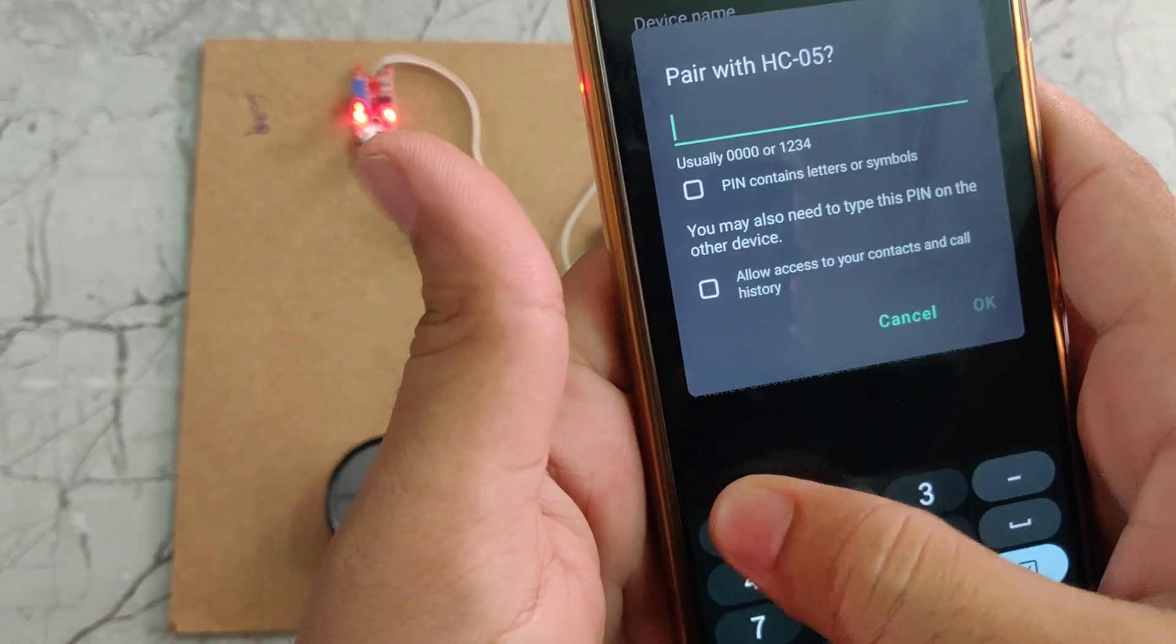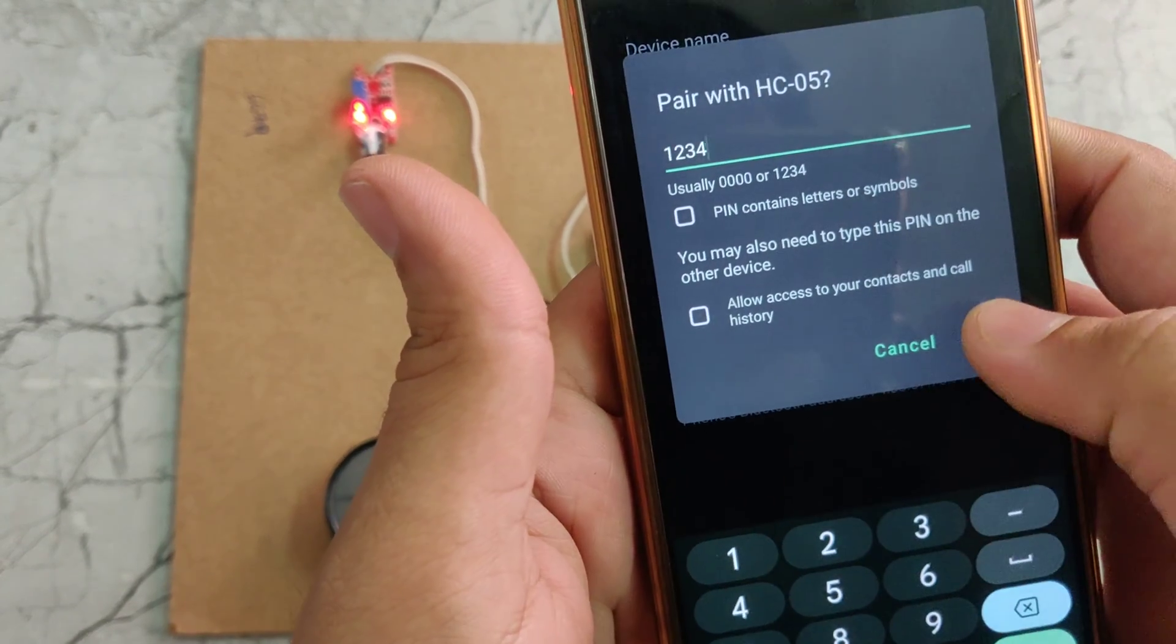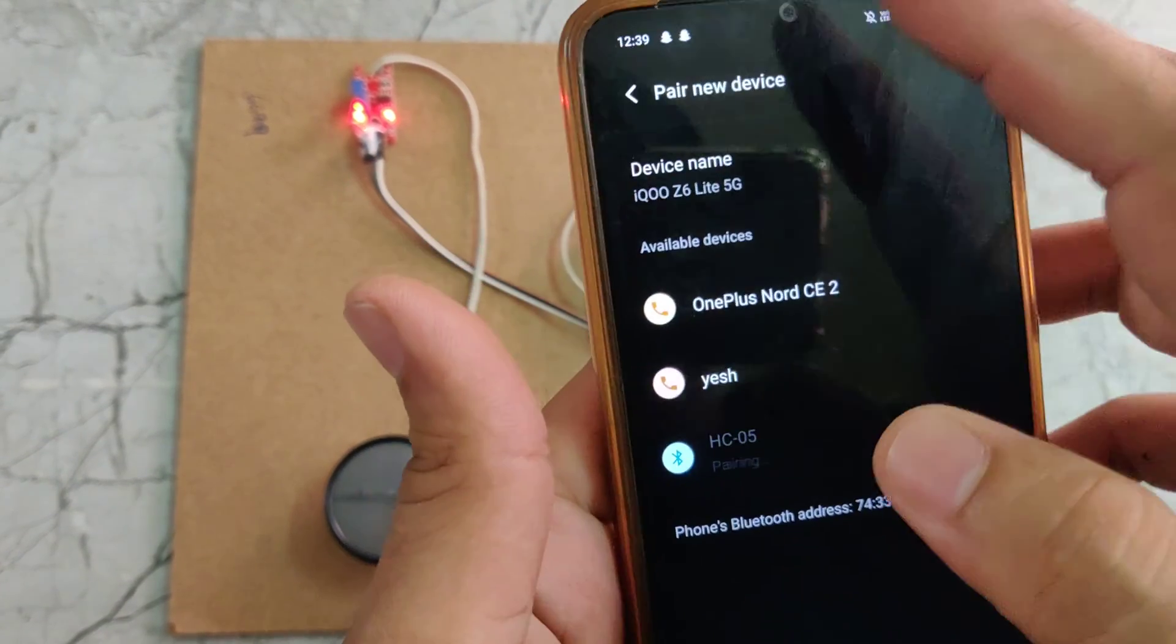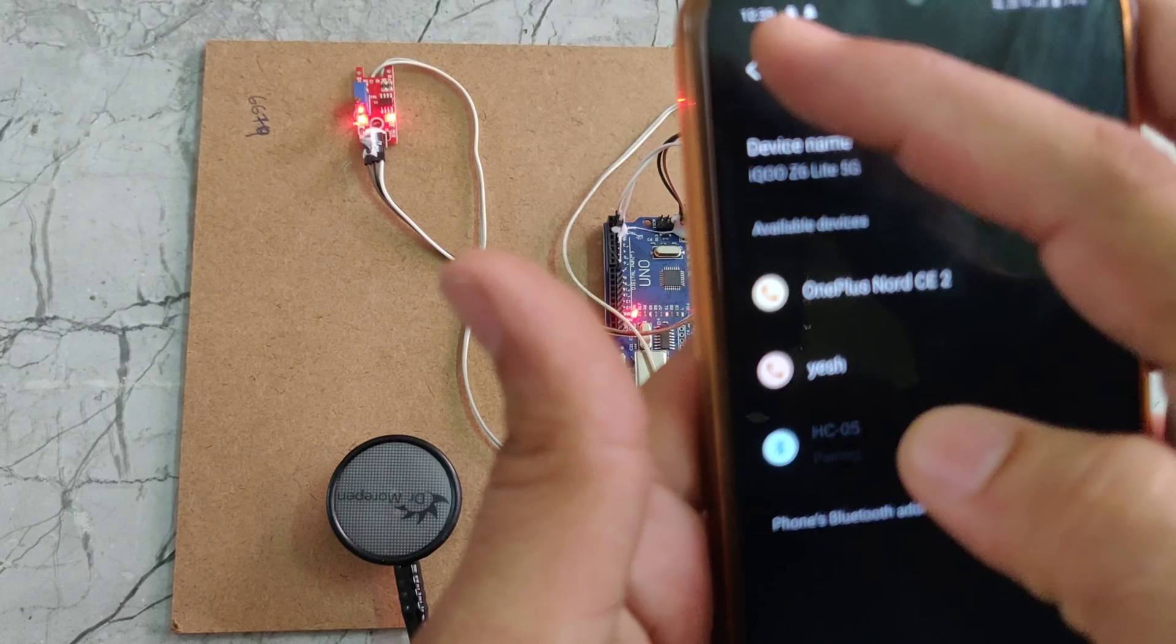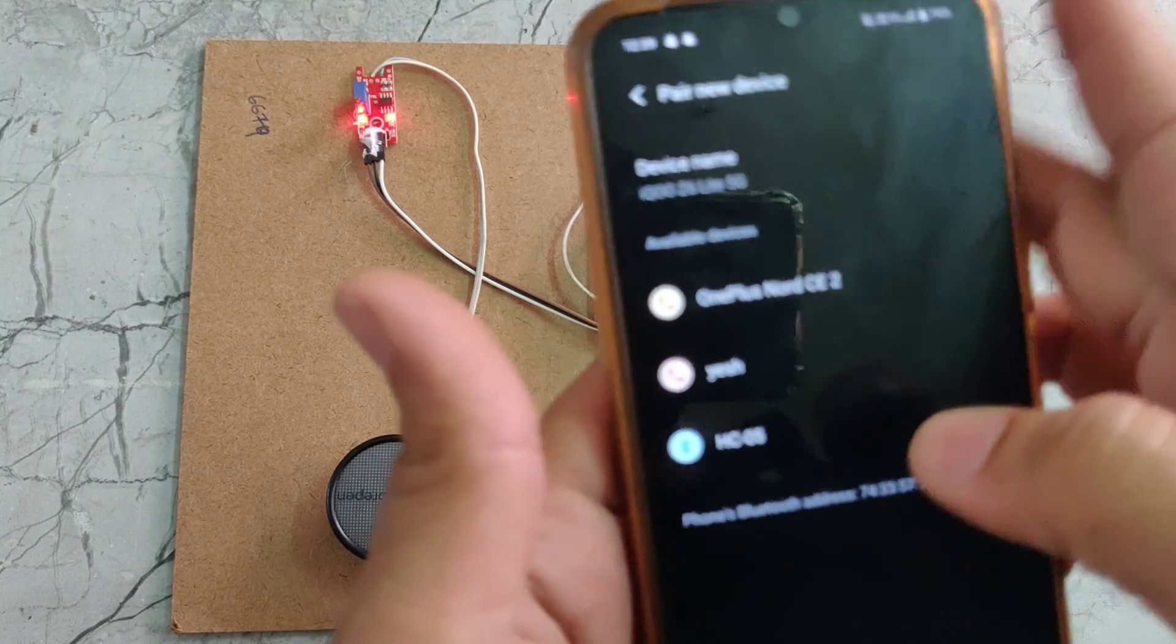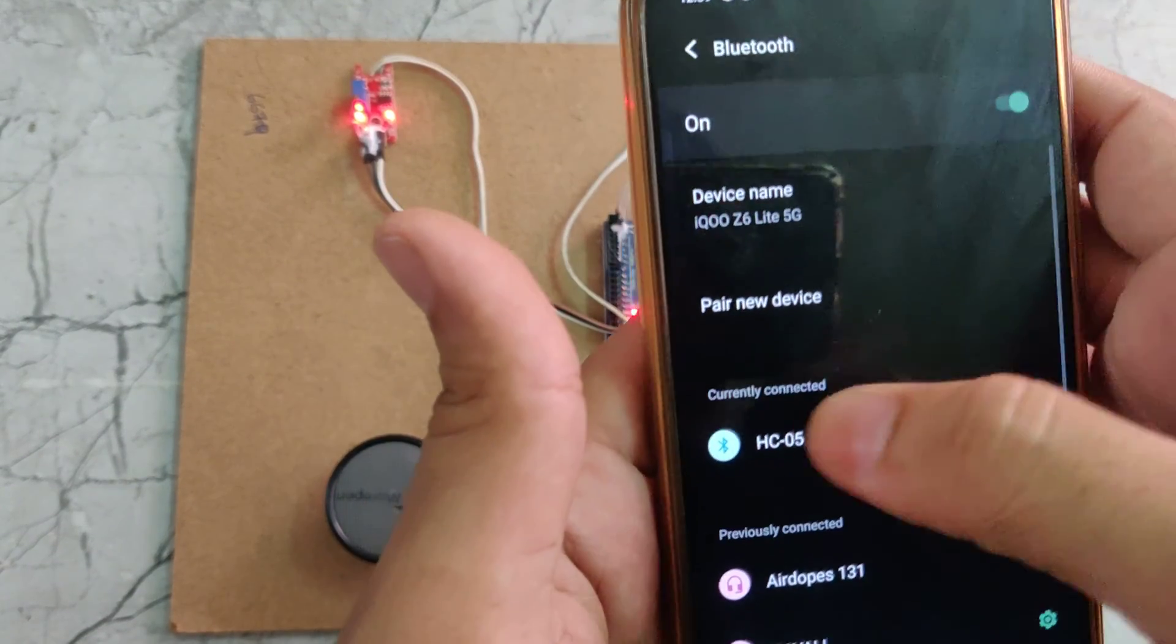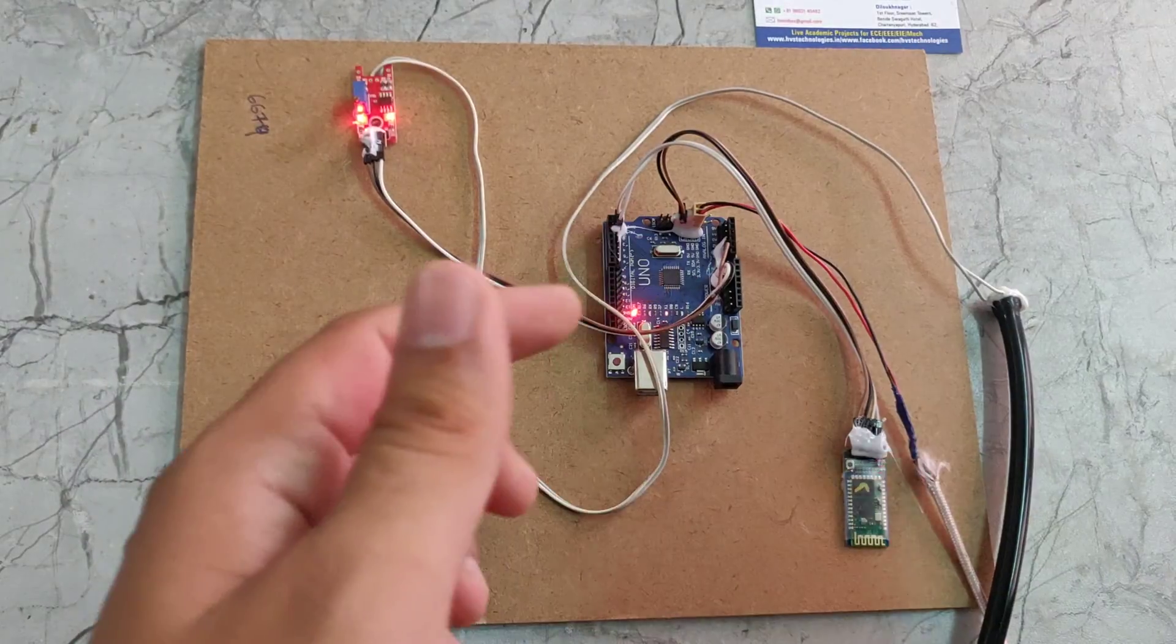It will ask for password. Password should be 1234. Now it is saved.